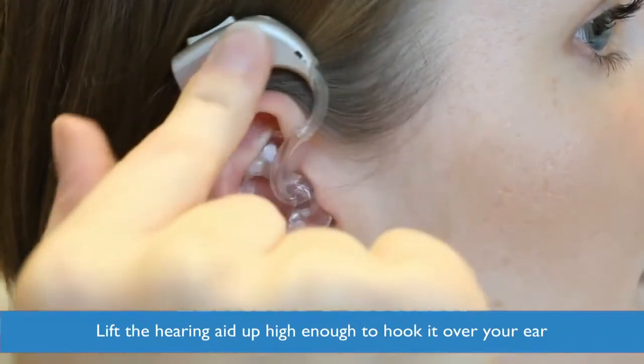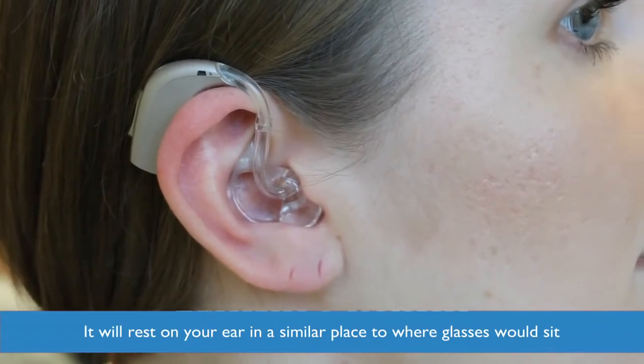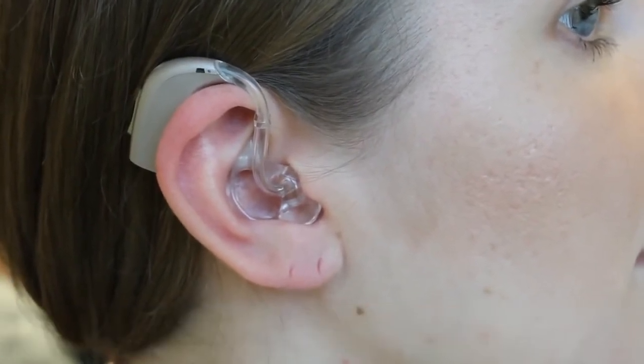Lift the hearing aid up high enough to hook it over your ear. It will rest on your ear in a similar place to where your glasses would sit.